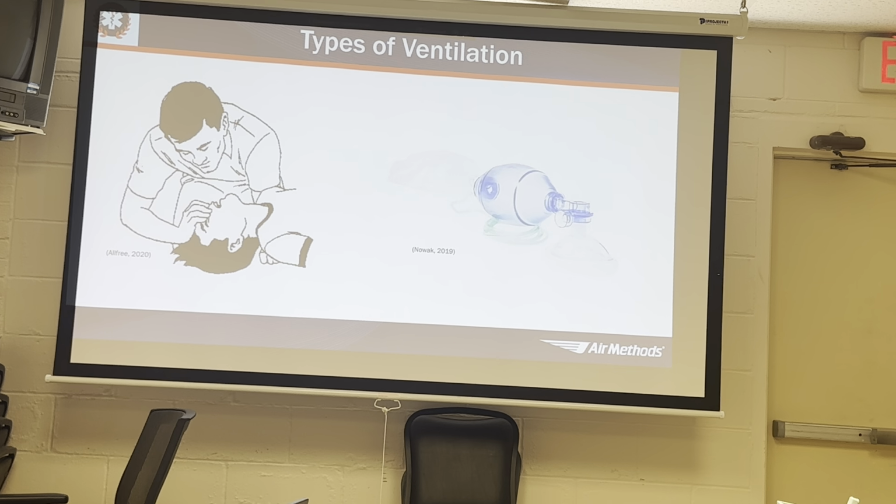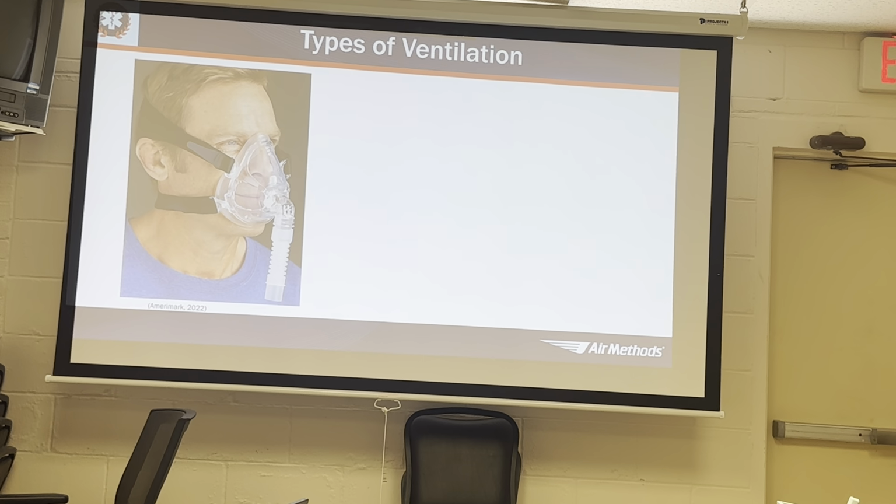I love this. So, types of ventilation: you could do mouth to mouth if you are so brave. And then bagging the patient, putting them on a ventilator, and so on. I've never seen anybody smile on a BiPAP mask, so it's a funny picture. And then obviously we have a mechanical ventilator.